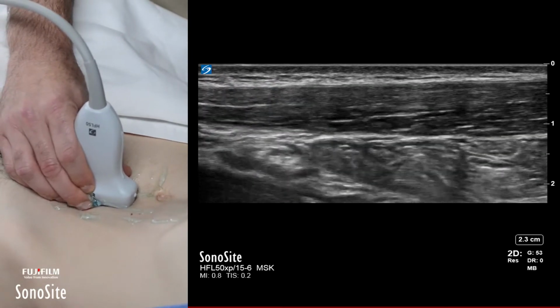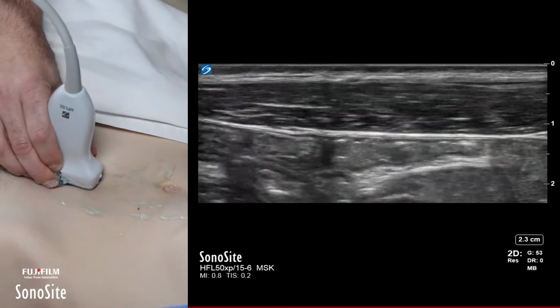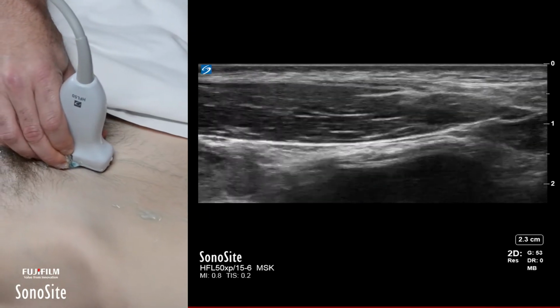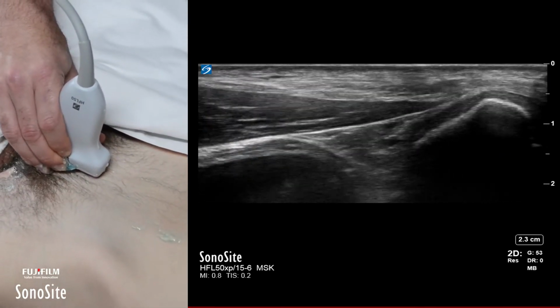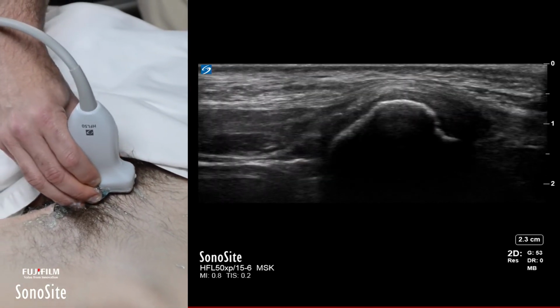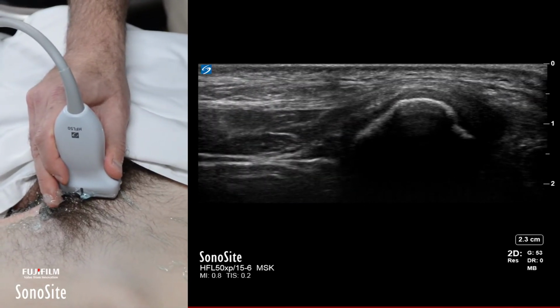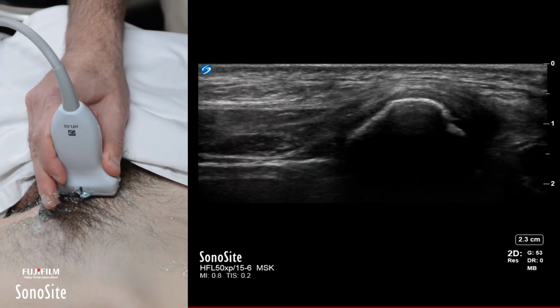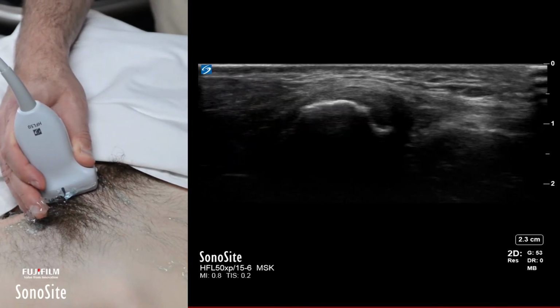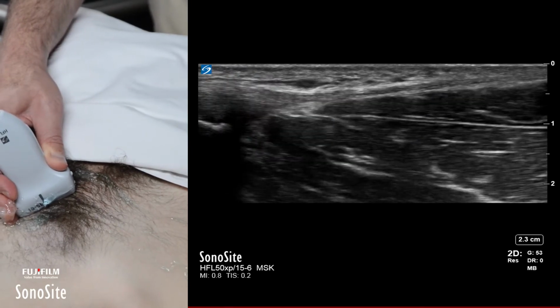But you know what's even better than a six-pack? A seven-pack. And the rectus abdominis actually is a seven-pack muscle because as I continue to go more distally, I can see that rectus abdominis muscle attaching to the pubic tubercle, and then if I rotate the plane, I now am in a plane where I have the rectus abdominis to the left proximally, and I have the adductor longus on the right, which is going to be going down inferiorly. And as I continue to go down, boom, that's where the adductors come in.